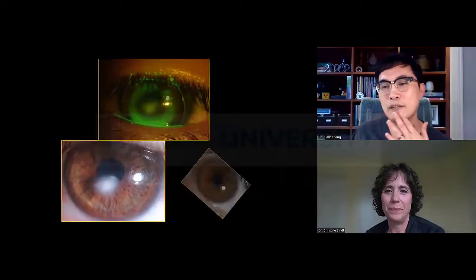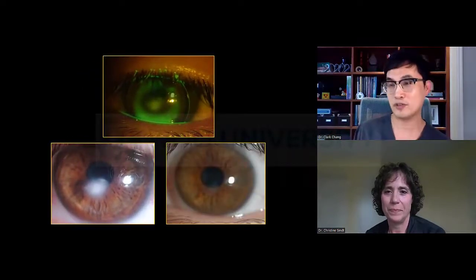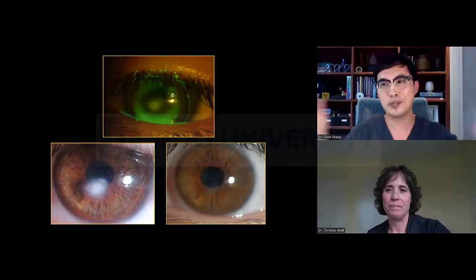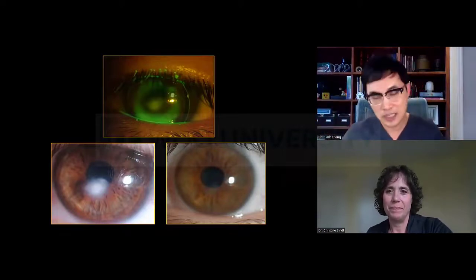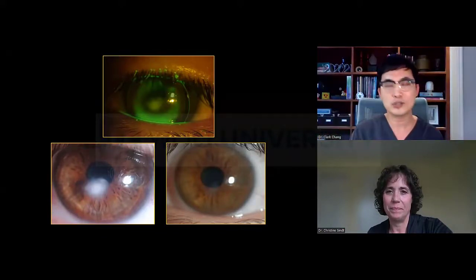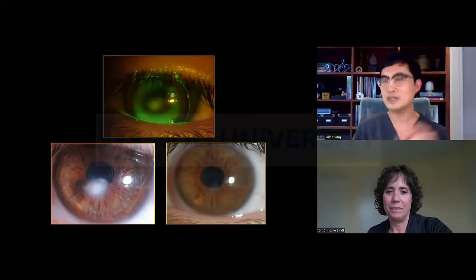So I thought, well, what if I would put him in a piggyback first? He just recently purchased a new set of lenses. He didn't want to purchase new lenses. We talked about scleral to maybe be able to maximally relieve that compression pressure. So I said, why don't we try piggybacking just for a few months? There's 3-6 months, and let me see you back.